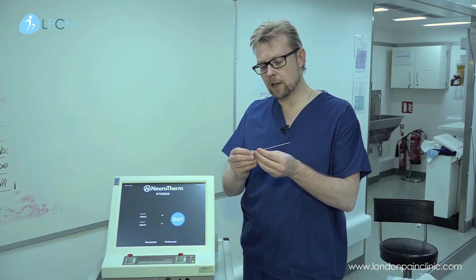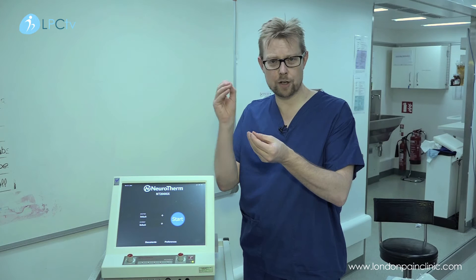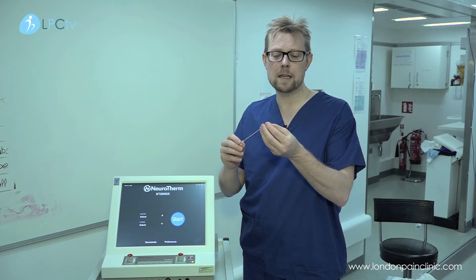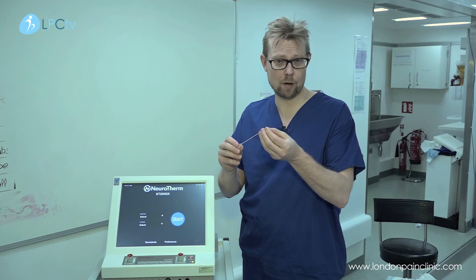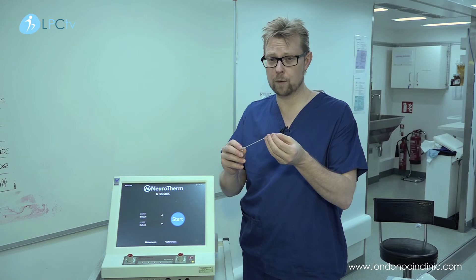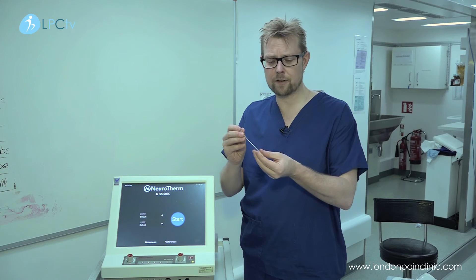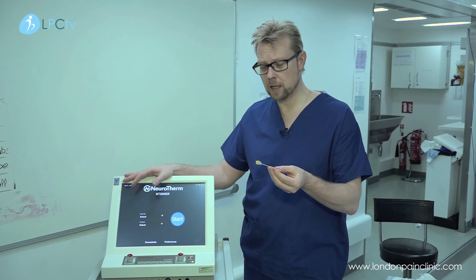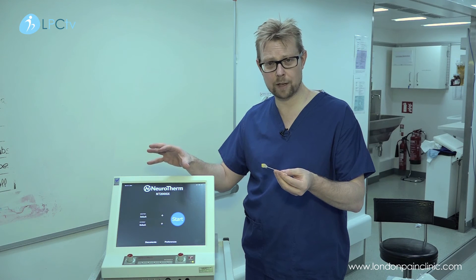Essentially, under X-ray or ultrasound guidance we will pass the electrode down to the nerve in question. The commonest procedure that we do is lumbar facet joint — what we call medial branch radiofrequency denervation — where we burn the little nerve off which supplies the facet joint. We stimulate using the machinery, using a sensory and a motor modality, to locate the nerve as accurately as possible.